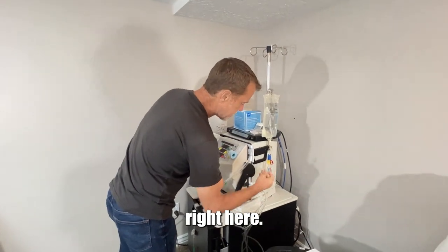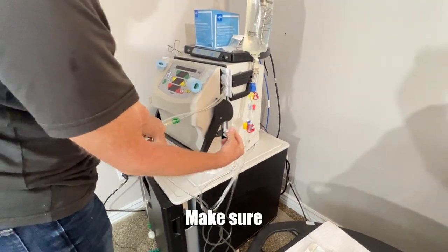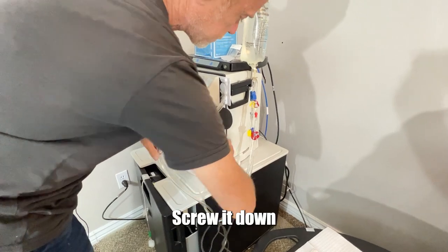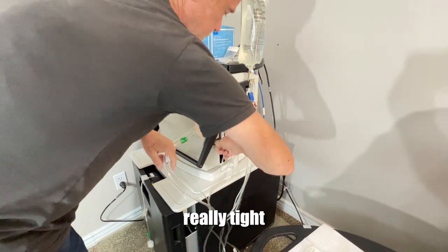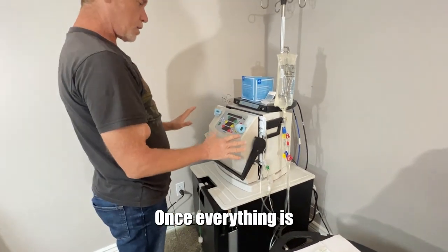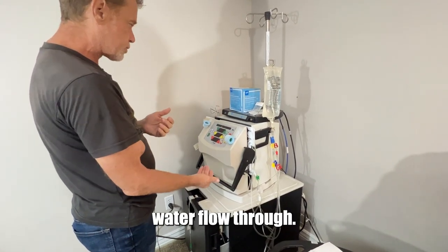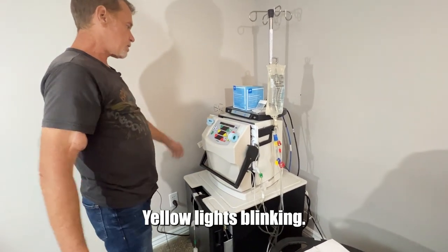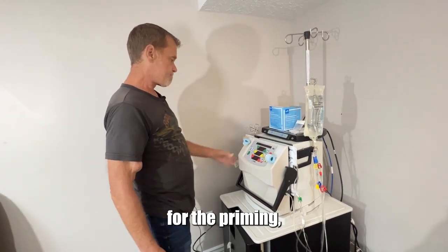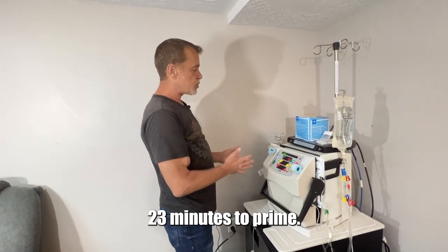Now this is the pressure pod right here. Make sure — this causes you massive problems if you forget this. Just screw it in here, screw it down really tight — good and snug. Once everything is hooked up: pressure pod, bag spiked, make sure you have water flow through, yellow lights blinking — then hit the start button for the priming. There we go, priming has begun. It takes approximately 23 minutes to prime.